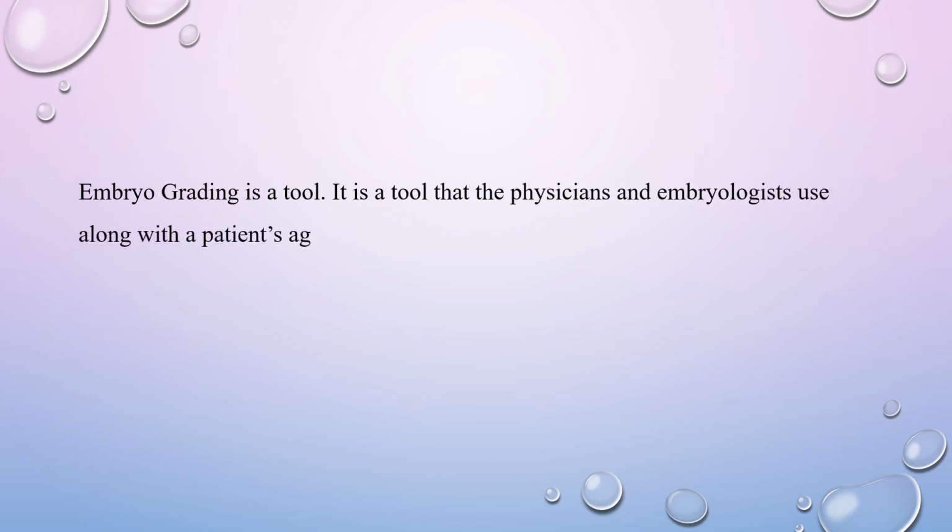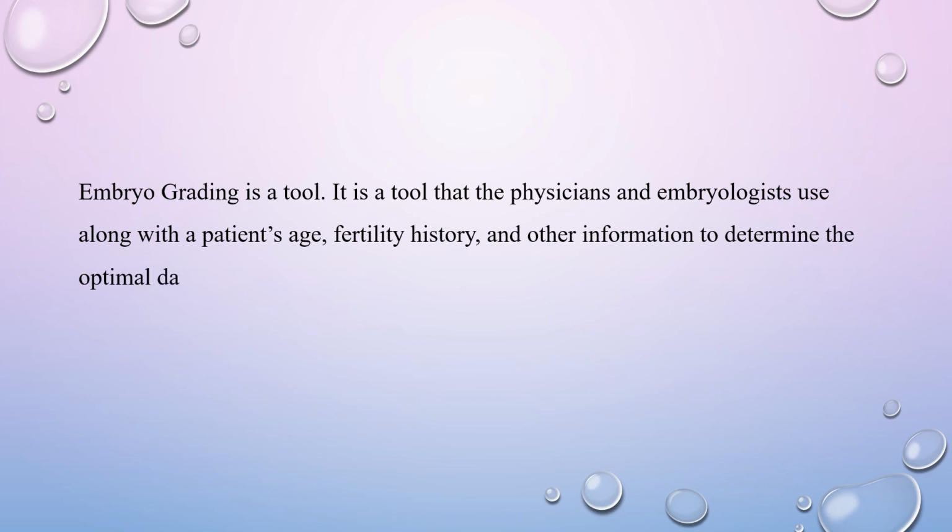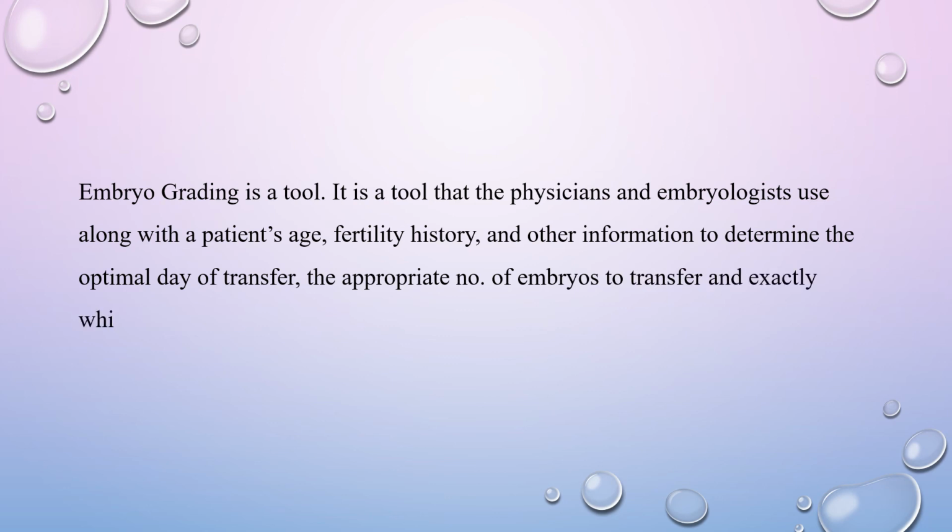Embryo grading is a tool that physicians and embryologists use along with the patient's age, fertility history, and other information to determine the optimal day of transfer, the appropriate number of embryos to transfer, and exactly which embryos to transfer.